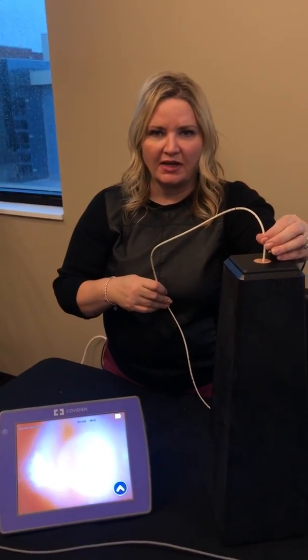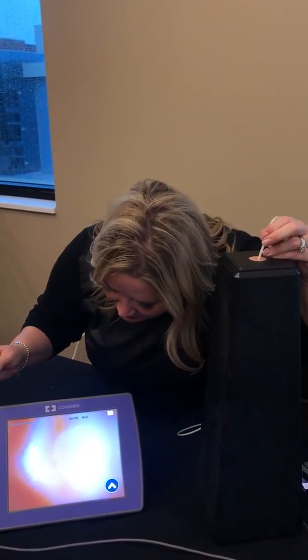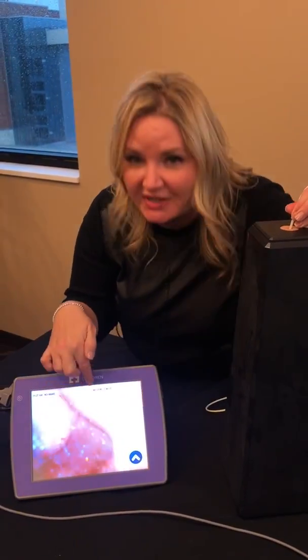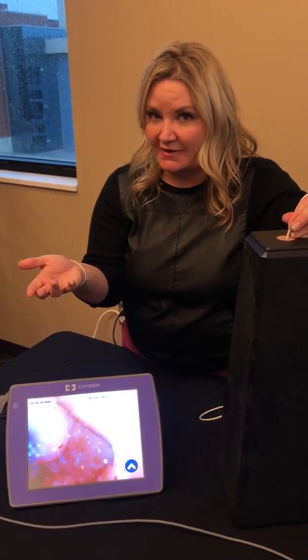So you're in the stomach. And we're in the stomach. Yep, you're pressed up against some tissue. Ooh, let's see, we're pressed up, so let's move back. So you can see those ridges that are indicative that we're in the stomach.